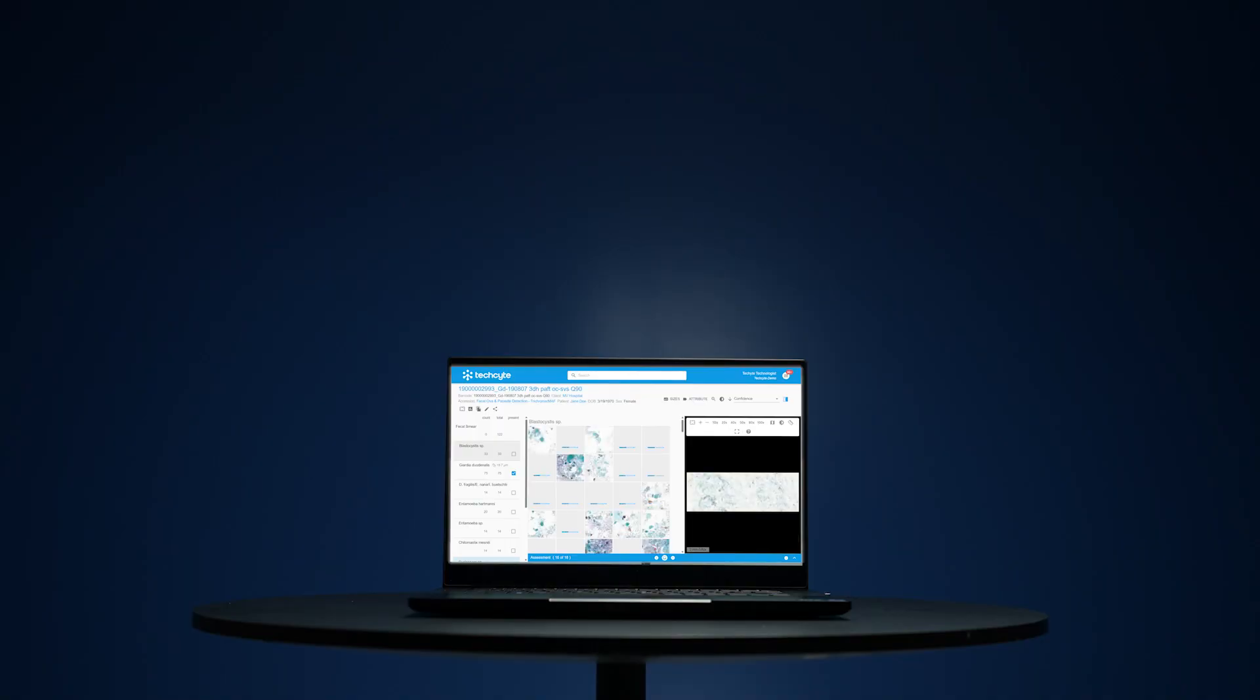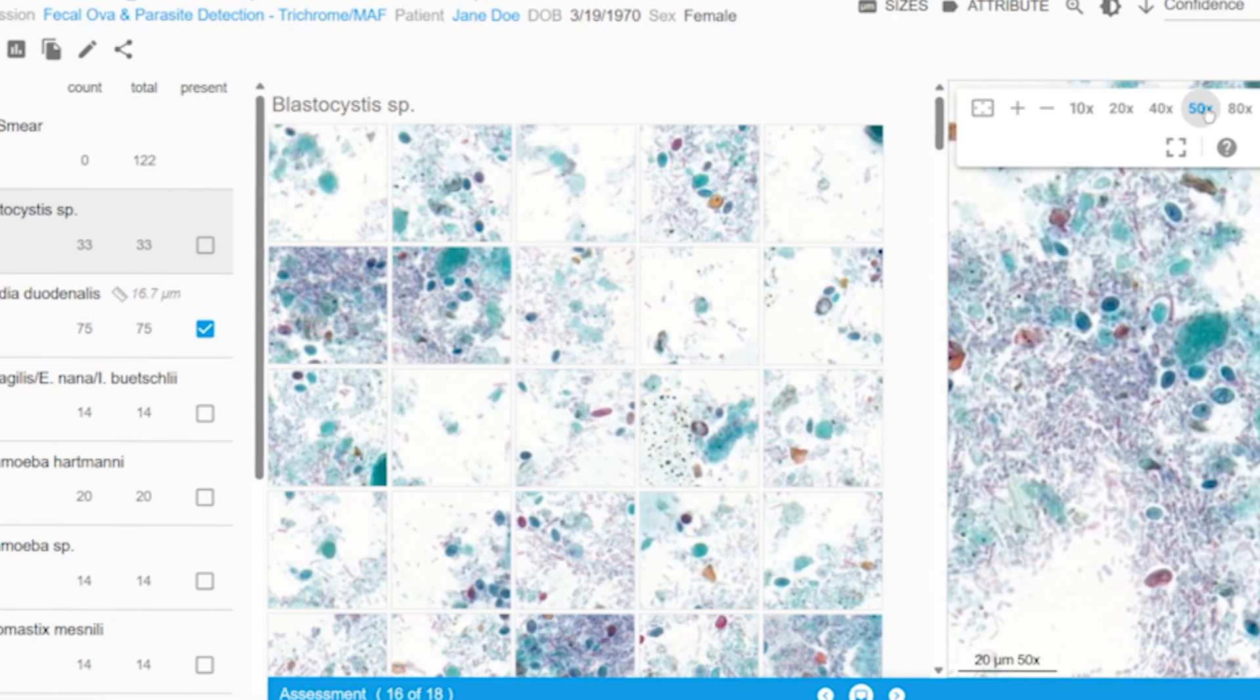It learns very much like we learn. Each image is broken down into thousands of features. All the model is seeing is those textures and features, that's the class of Entamoeba.